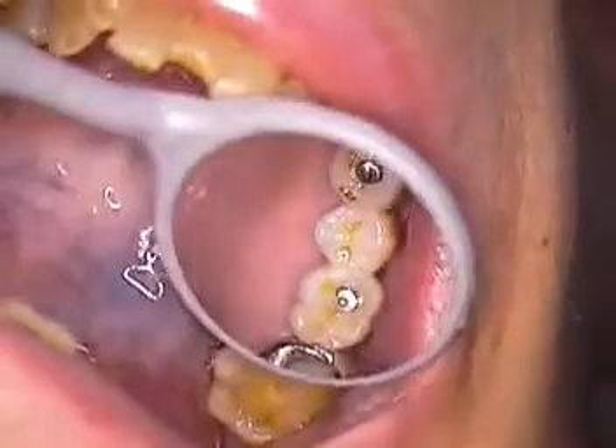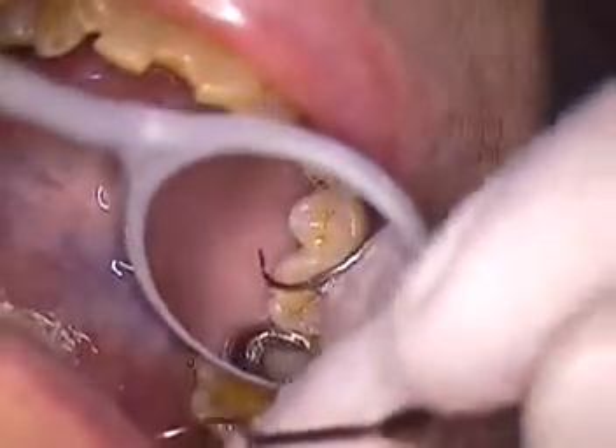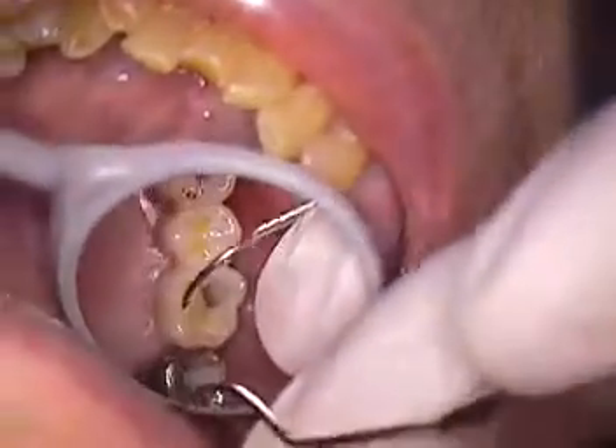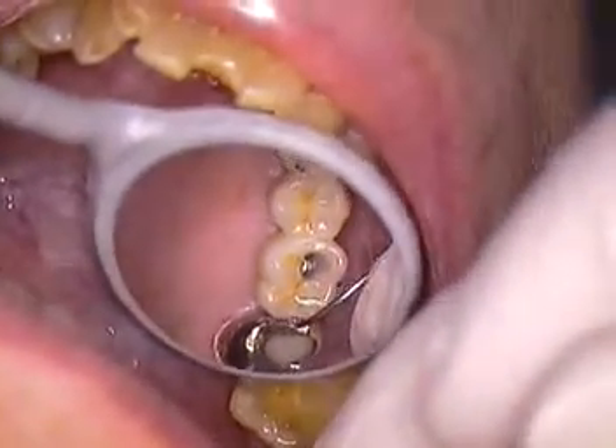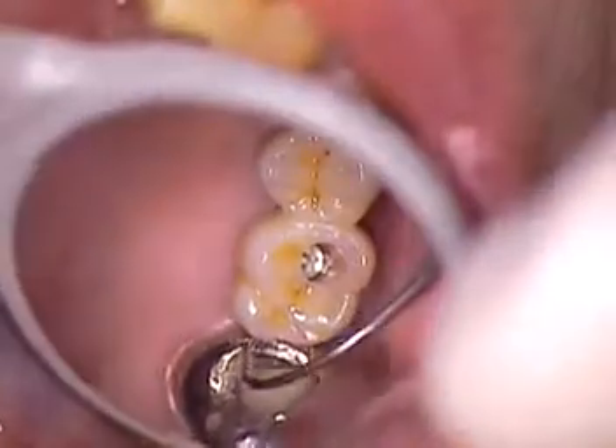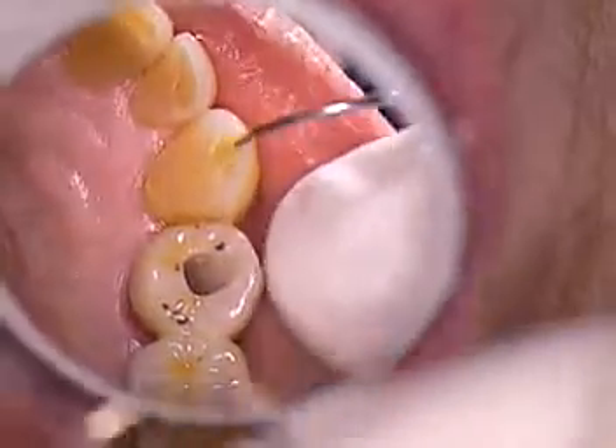And we like that. Some dentists might want a larger table — I like to keep them narrow. It's less force on the implant and less worry. I do like broad contacts, nice broad contacts, and it looks like they were very successful in doing that on both the distal of this cuspid and the mesial of this molar here.